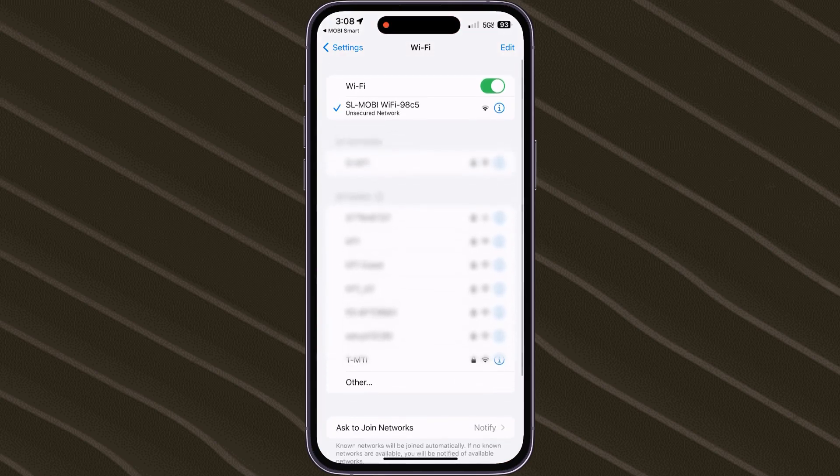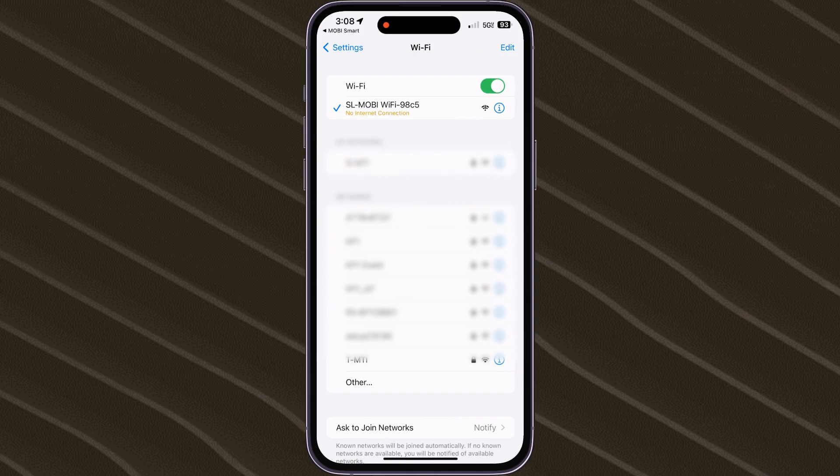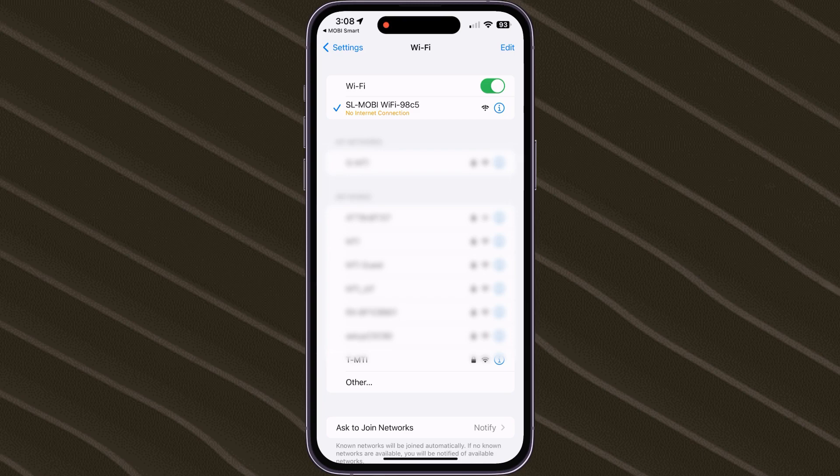After connecting, if your smartphone says No Internet Connection or Connected Without Internet, that's the indicator that we have successfully connected to the Otoscope's hotspot connection.